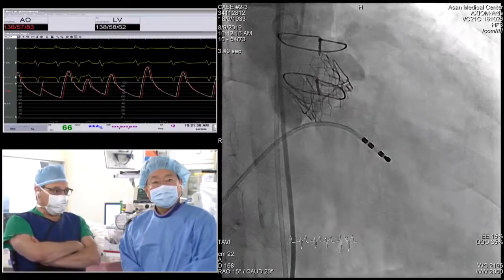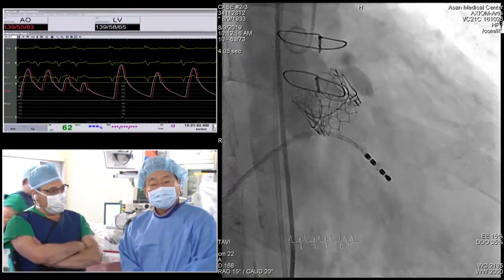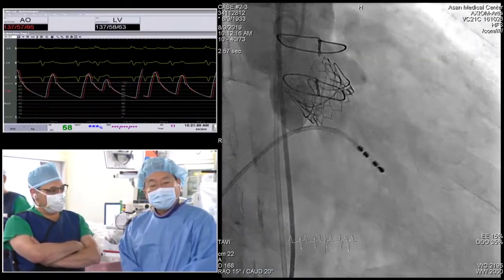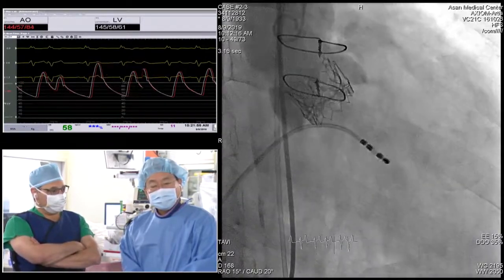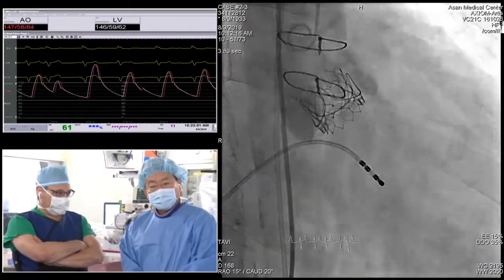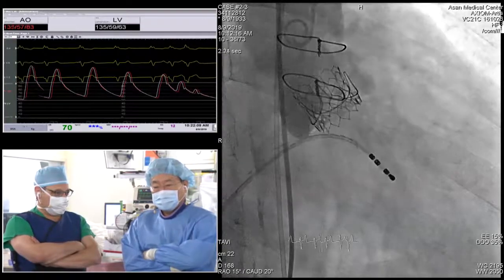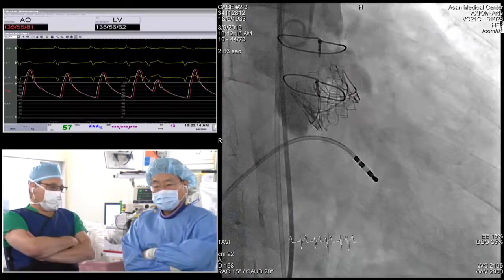Sure. So, David and SJ, as far as the valve selection is concerned, wouldn't you agree, at least in theory, and in fact for me in practice, the smaller the surgical valve, the higher the probability of post-dilatation slash cracking. And for the smaller valves, the better option is to use a self-expanding supra-annular device. Is that in general true?